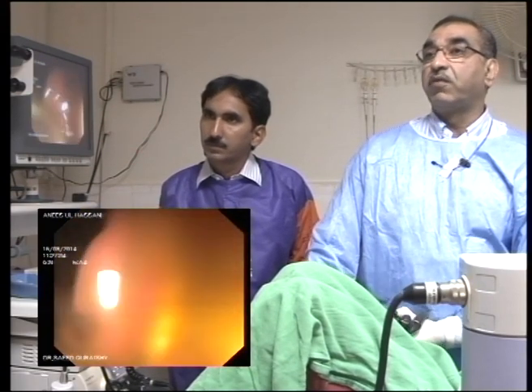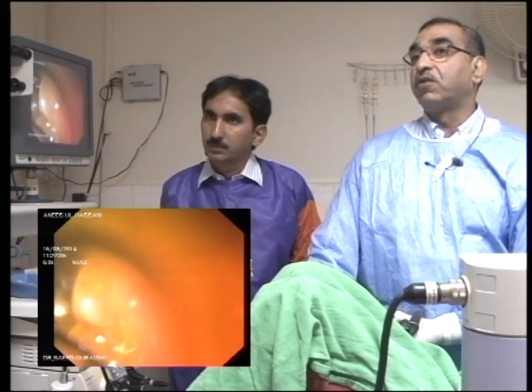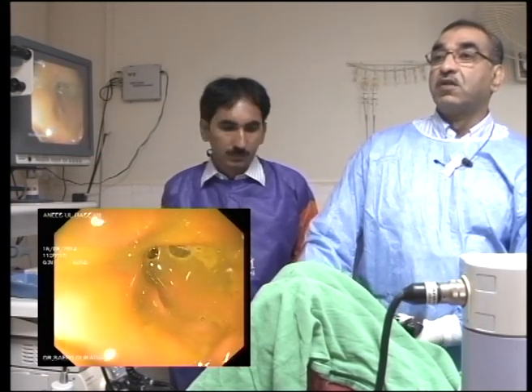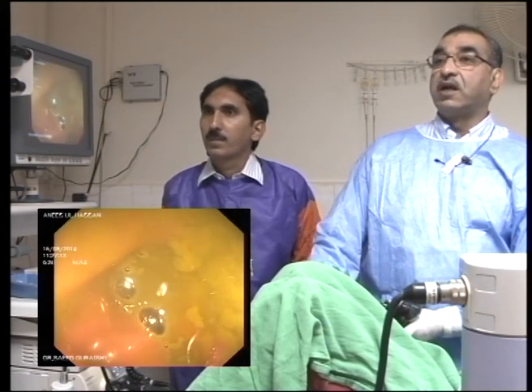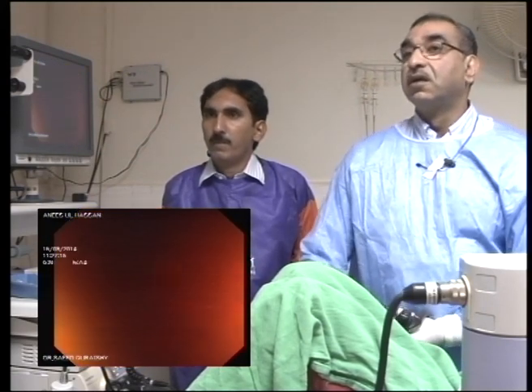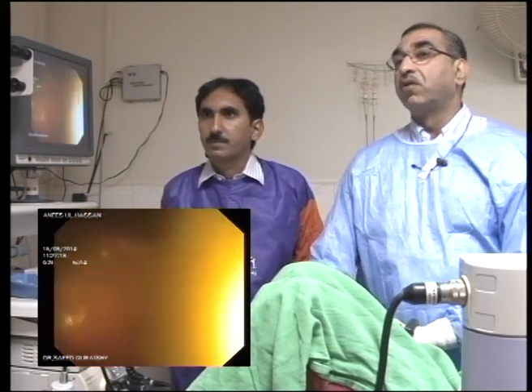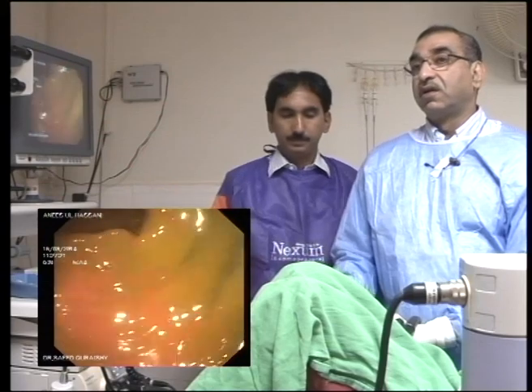So point away from the fold that comes in front of your eye. We'll move away from it, we'll look away from it, right? So when you have cleared it, you go over it again. Here it is a bit dirty, so you won't be able to see much. Okay, so you carry on with your withdrawal, right?